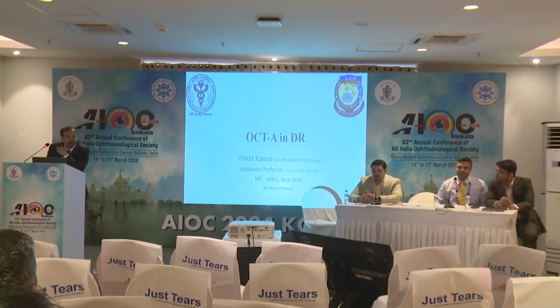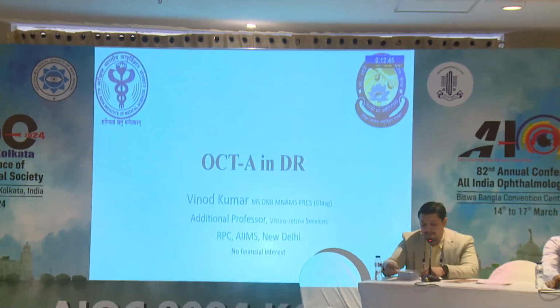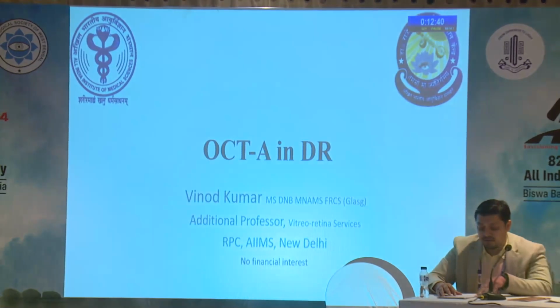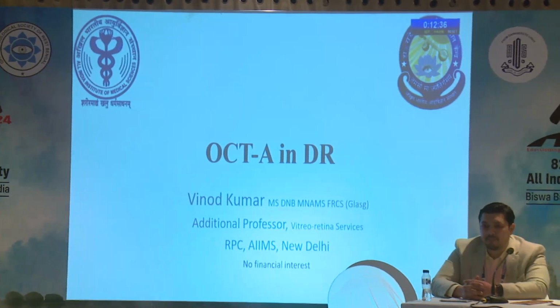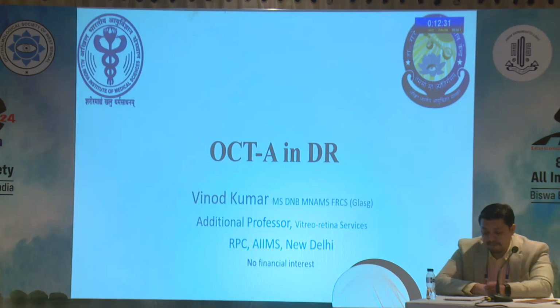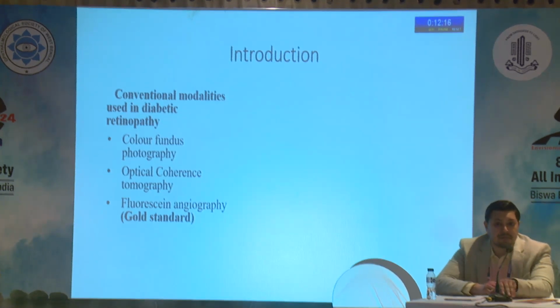We know that people are always gaga about OCTA, and so what I am going to tell you is what has been our work on OCTA in patients with diabetic retinopathy, and what the current literature suggests, what we can do with OCTA in the current scenario. And third is what I feel is my judgment in today's scenario, what all we can do with OCTA in patients with diabetic retinopathy. So when it comes to diabetic retinopathy, we know that color fundus photography has always been the standard.